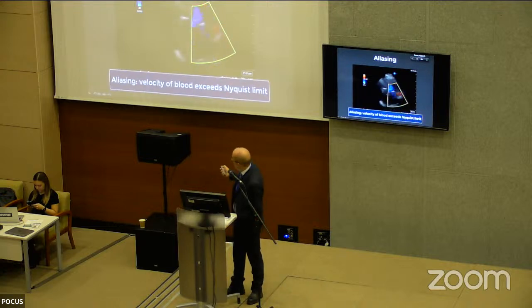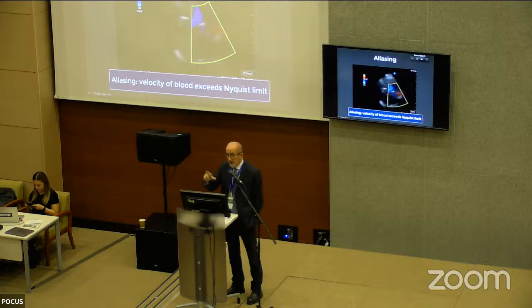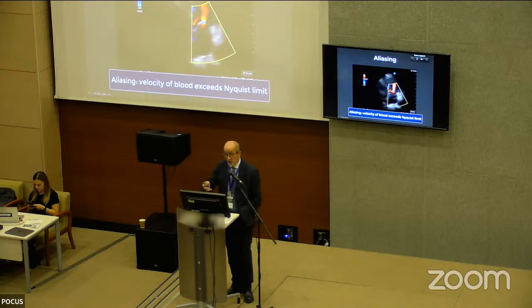So this is the same patient here with the mitral lesion. In diastole, there is a sort of mosaic due to the high velocity. And by the way, in systole, we have the backward flow towards the left atrium, showing the presence also of mitral regurgitation.